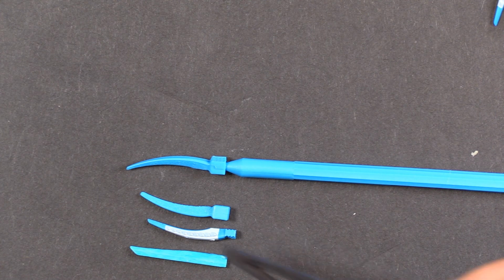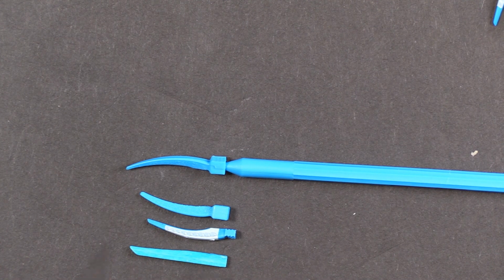So if you're using a wedge wand and it's still too short, you might want to check to see if you're working on a horse and not a human, because by golly, that's a big tooth right there. So now the yellow ones are quite a bit shorter than that. The smallest one is much smaller than that, but the blue, orange, and green are all about that length.